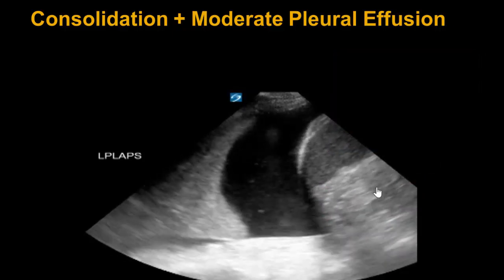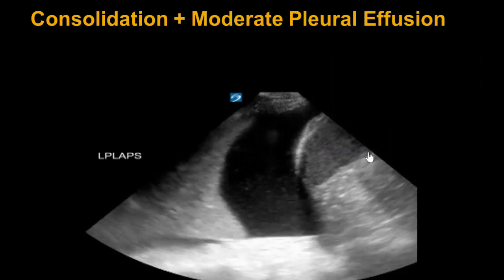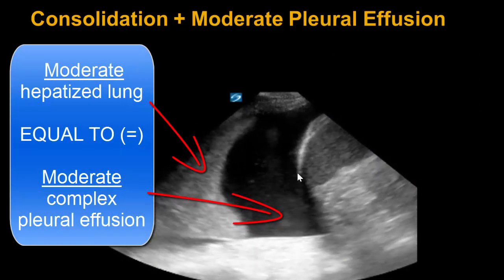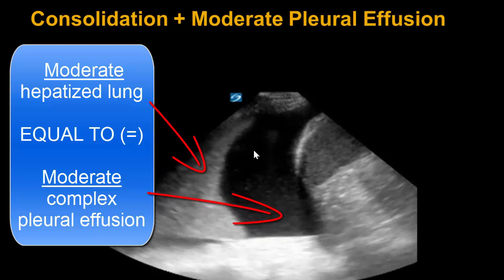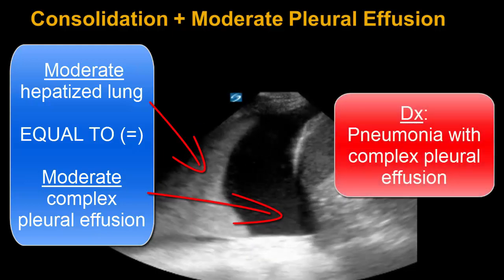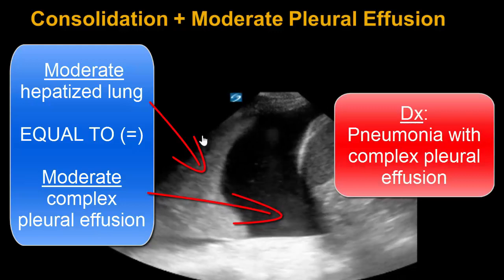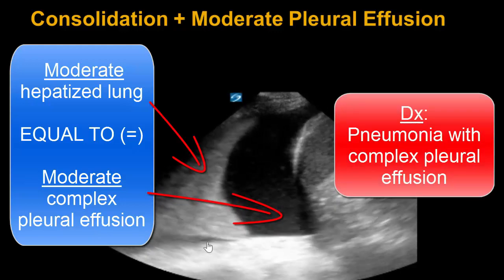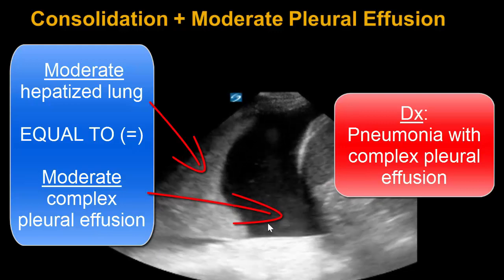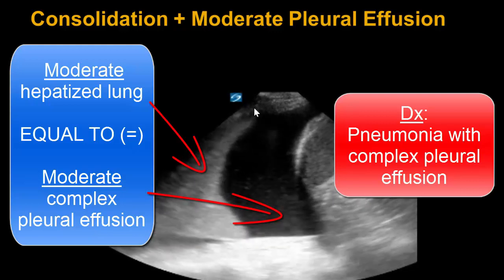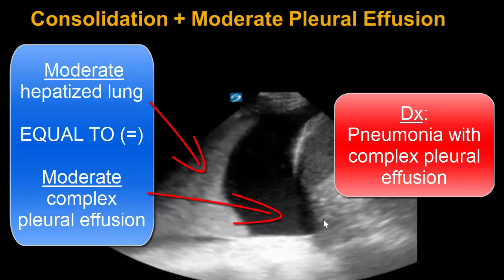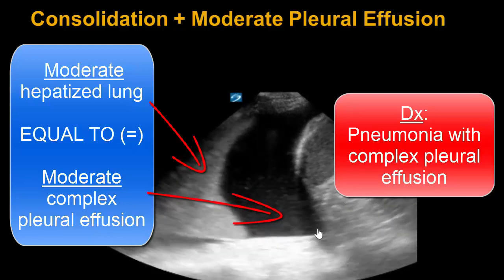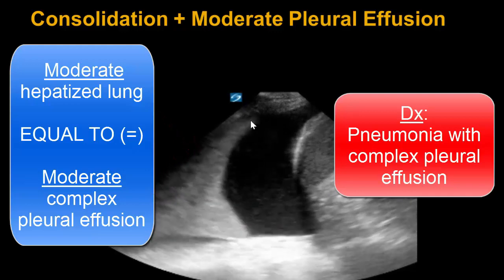To put this all into context, we have a similar sized consolidated lung compared to a similar sized pleural effusion with evidence of complexity. This would again support lung consolidation due to pneumonia as being the primary process, with a secondary complex pleural effusion. An important learning point here is that this effusion certainly needs to be drained on an urgent basis.